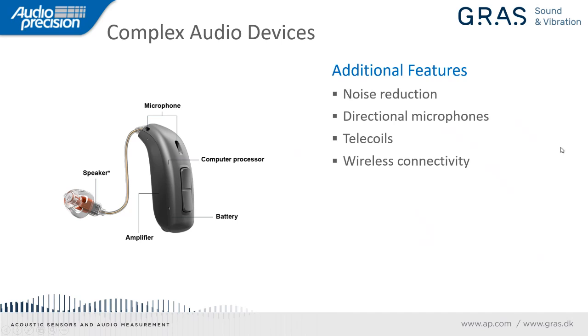They can have wireless connectivity. Now, there are many hearing aids that support Bluetooth, and this is becoming increasingly important, especially with a new standard that the Bluetooth SIG has just developed for hearing aids. They can have remote controls, so you can control the hearing aid from an app on your smartphone, for example. Some of them have direct audio input, so a little small analog input that you can connect a different device directly to the hearing aid.